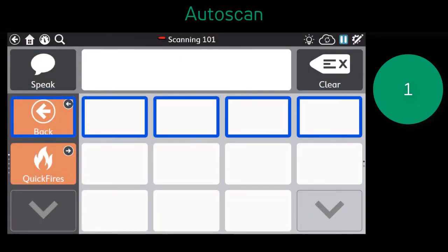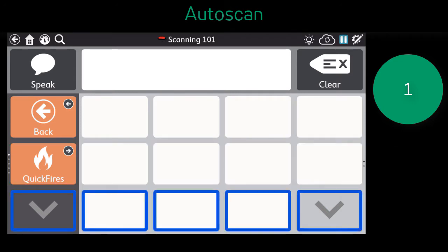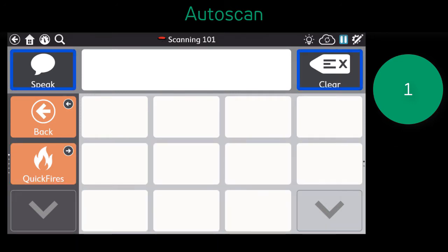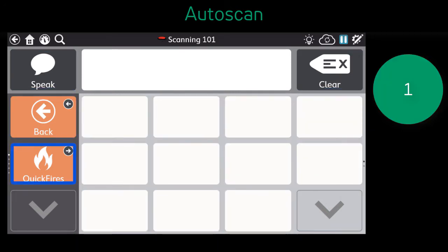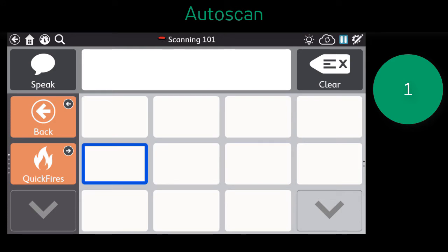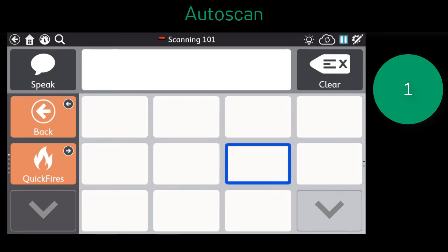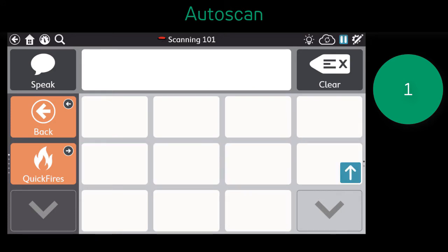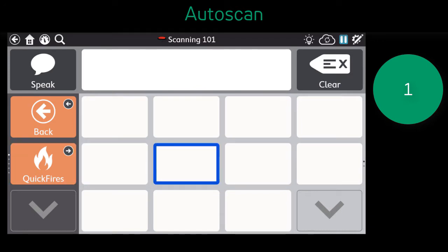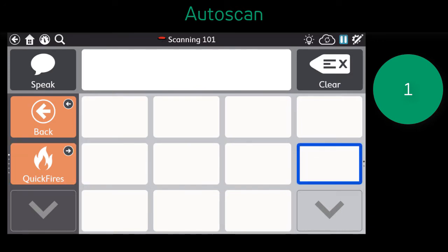As you watch this video, notice the scan indicator, or the blue outline. The scan moves automatically, and the switch, pictured on the right, is only activated or turns gray when a selection is made. The scan user does not have to do anything to move the scan indicator.